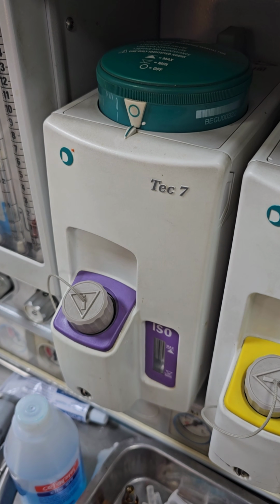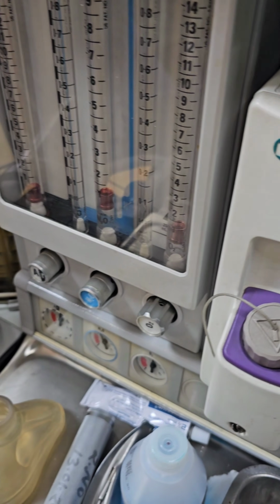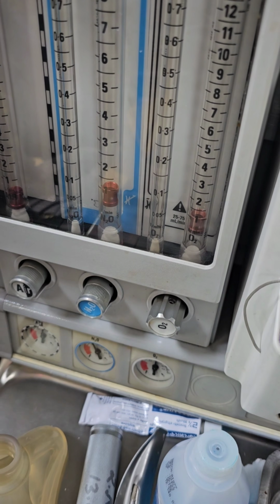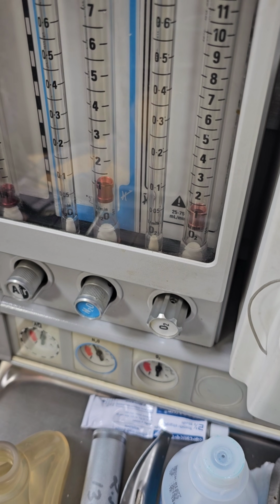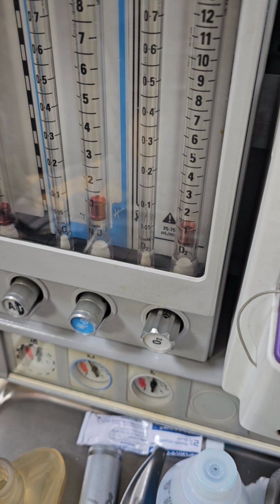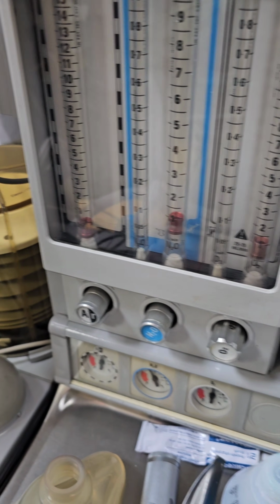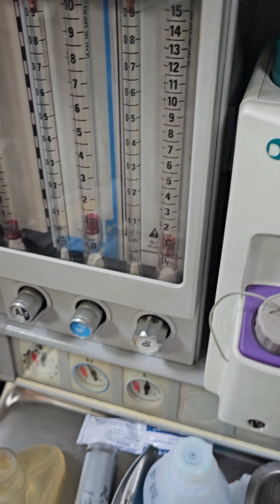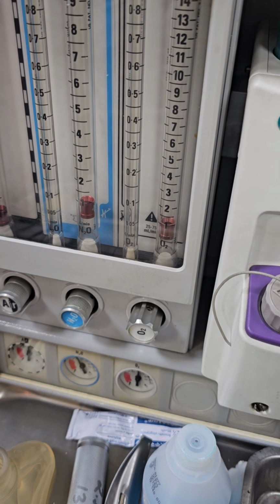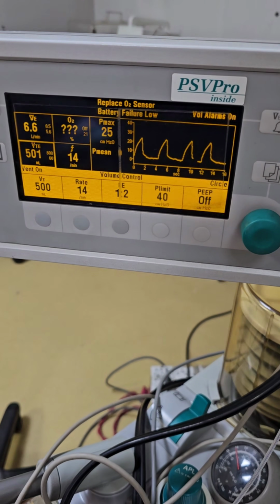So when the surgeon is starting the closure of the ports, we reduce the total flow and convert it into low flow anesthesia, and we stop the isoflurane. The benefit of low flow anesthesia is that the anesthetic agent and nitrous in the circuit can be reused for the rest of the time, and we can save some money for the hospital and for the patient.